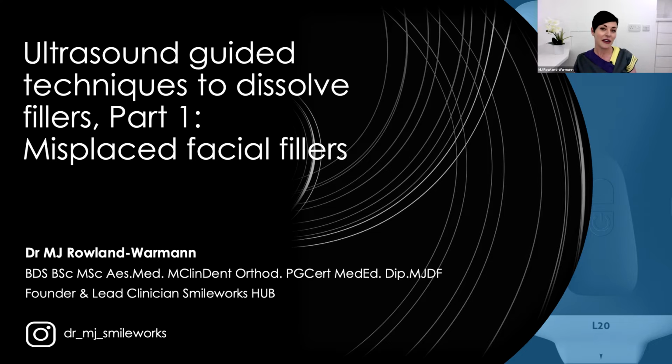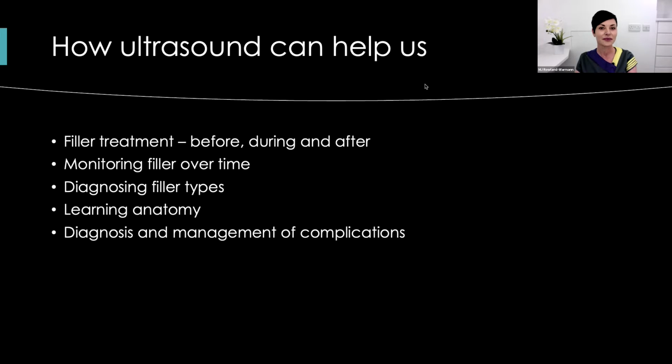I've been using the Clarius L20 in my practice for around 2 years now, and I'm not kidding when I say it may be the best money I've ever spent. But let's not waste time singing its praises. I'm just going to go ahead and show you how great it is. Those of you who joined me for my last webinar a few months back will know that we can use ultrasound in aesthetic practice for a whole host of different indications.